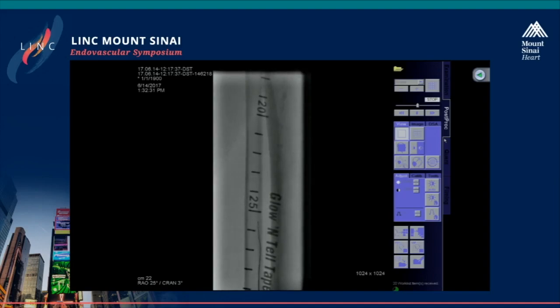Ray, puff. Little puff, Ray. So I think this is an advantage. We have a catheter down below at the level of the... Nah, I don't like it. I think it's in a spiral. There it is. All right, good.